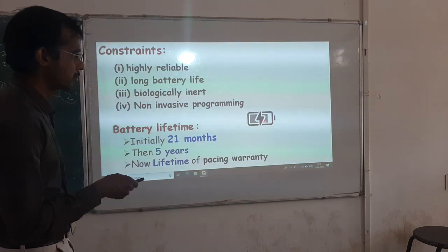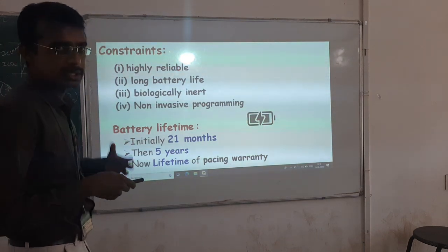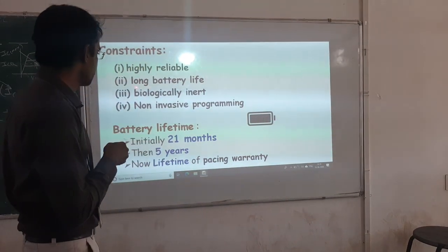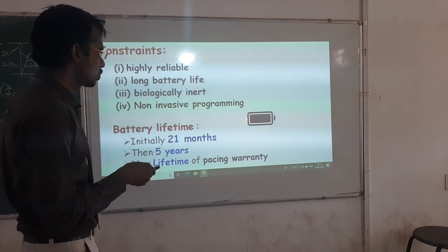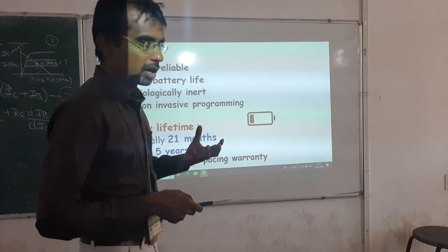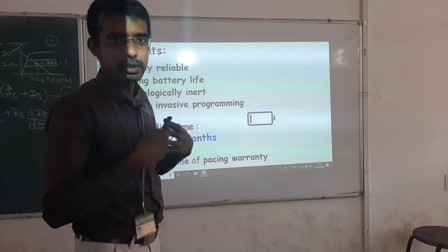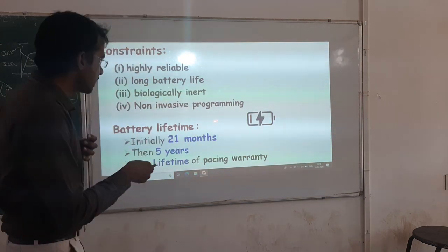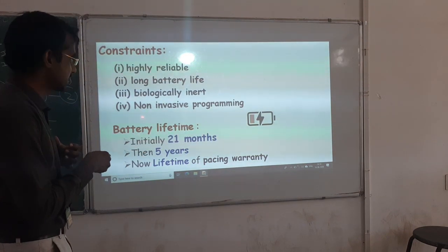The second one is battery. Once you place it inside, you should forget it for the next 15 years, so it should have a long battery life. The next one is biologically inert, which means it should not react with biological fluid.